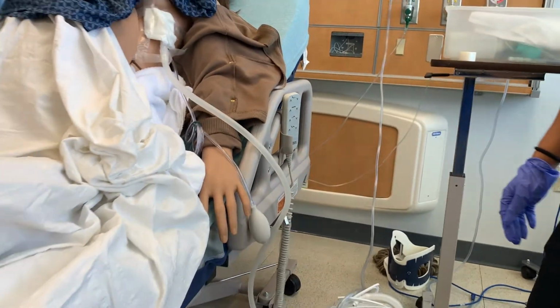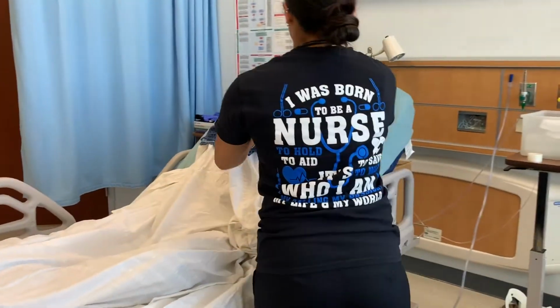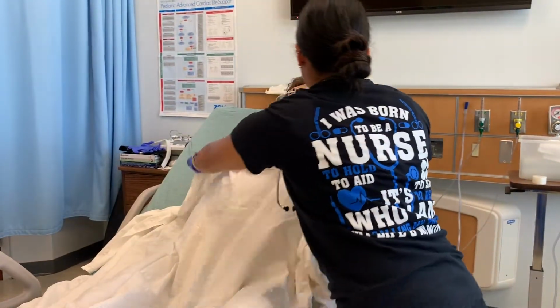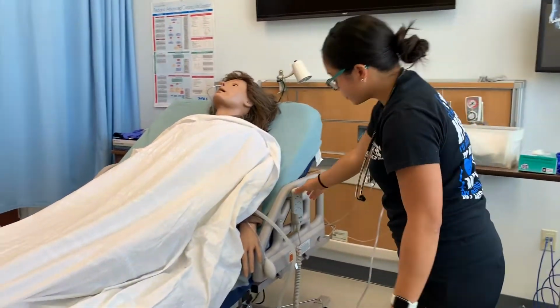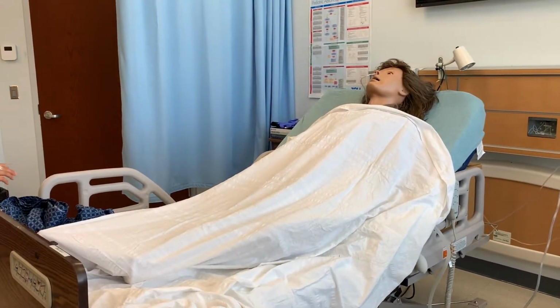When the procedure is complete, perform hand hygiene and leave the patient safe and comfortable with the bed low and locked, bed rails up, and call light within reach. Complete documentation using forms, checklists, or other electronic options.